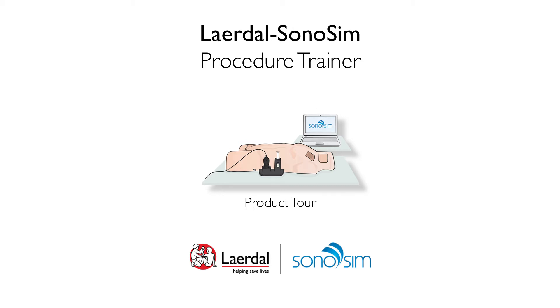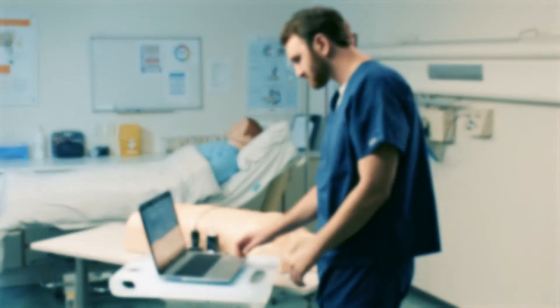Thank you for purchasing the Leradol Sonosim Procedure Trainer. This video will show you how to use your Procedure Trainer.